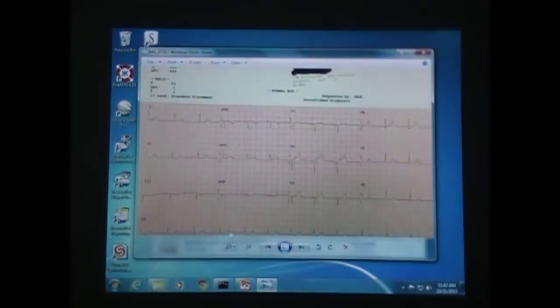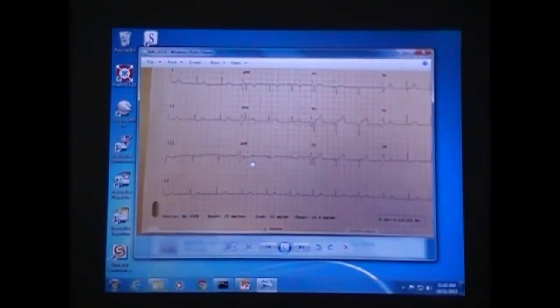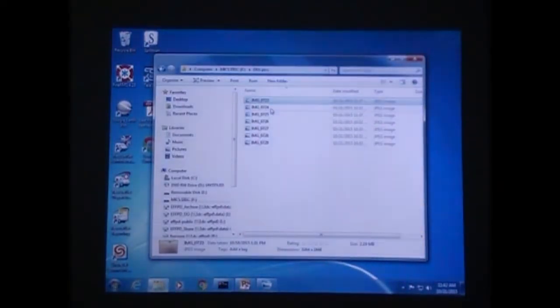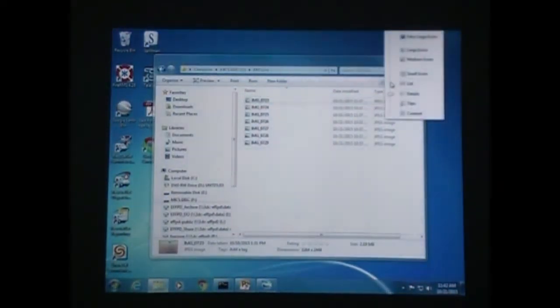All right, so this is actually a patient that you guys brought in on Monday. So we're going to kind of look at it. That's one of our 12s? No, this is here. Let me. I was like, this is the. Let's see if I can find. I was like, that can't be ours. That's too clean. Where's the icon? Where's the?